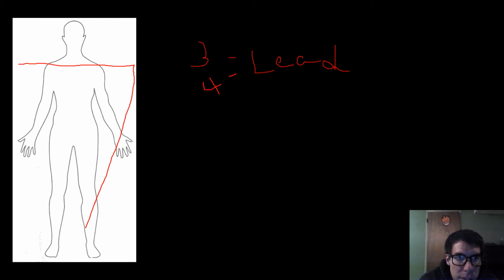Yeah, like that. So this is called Einthoven's triangle. This tells us what leads are looking which way. From the right arm over to the left arm, that is lead 1. And remember, leads are the space between electrodes.